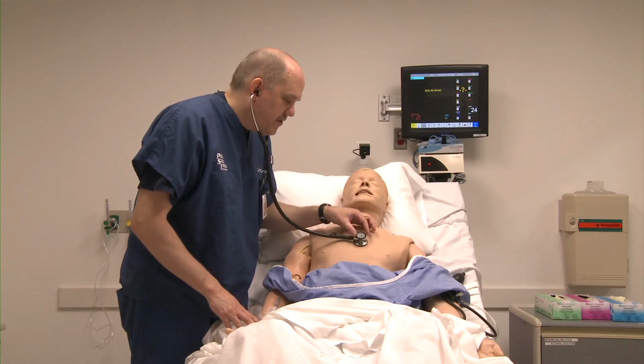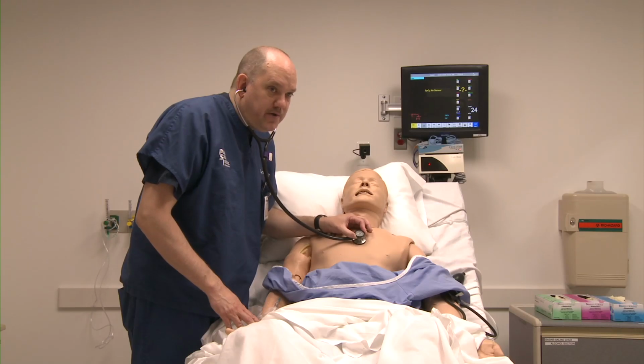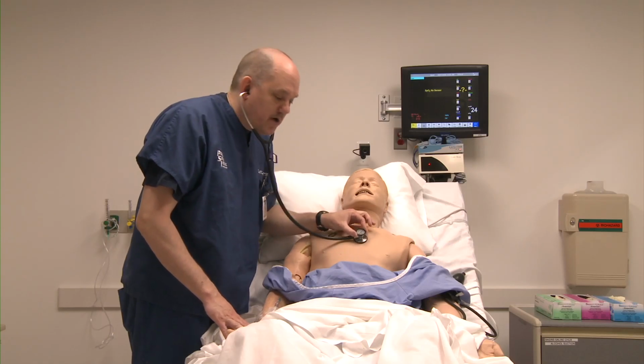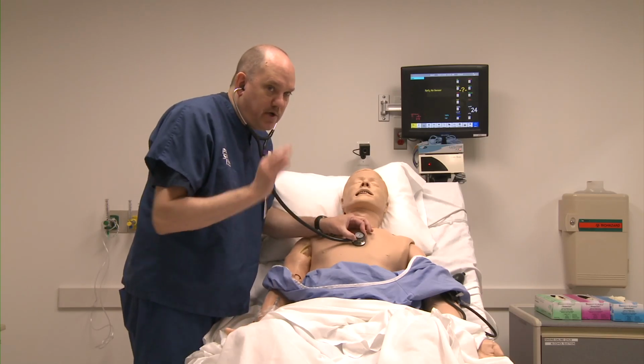Note that if you move your stethoscope, even a quarter of an inch either way, you'll not hear a very clear sound of the heart rate. You'll hear a washout from other speakers in the chest. So if you're not hearing what sounds like a heart rate, you may want to reposition your stethoscope by a quarter of an inch either way until you hear it crystal clear.